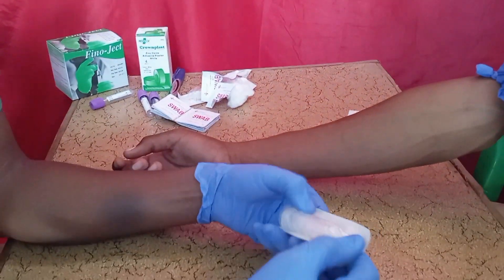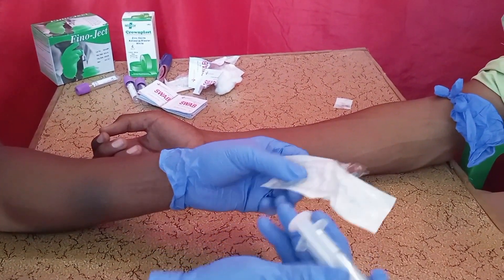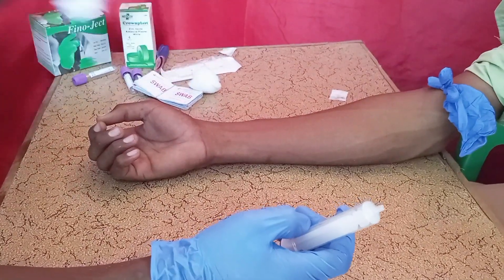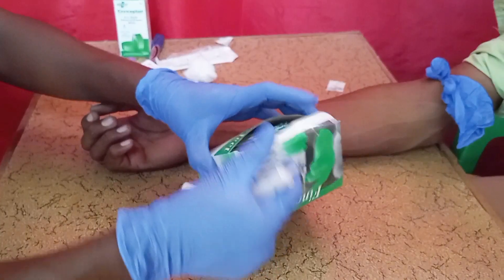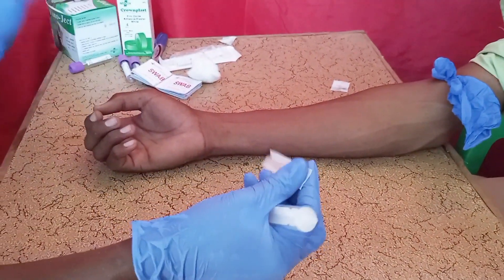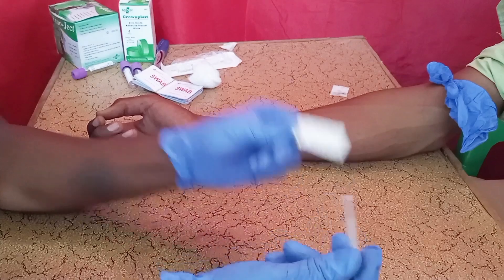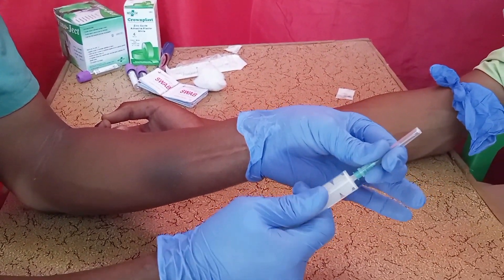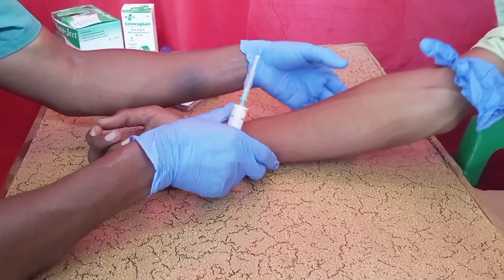Get the syringe and remove it from the manufacturer's packaging. Also get the 21-gauge needle, remove it from its packaging, and attach it to the syringe. Then you are ready to start taking the blood safely.